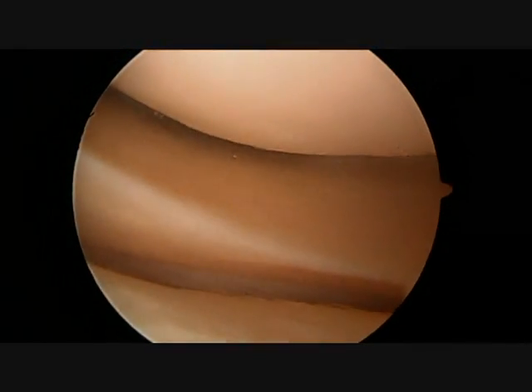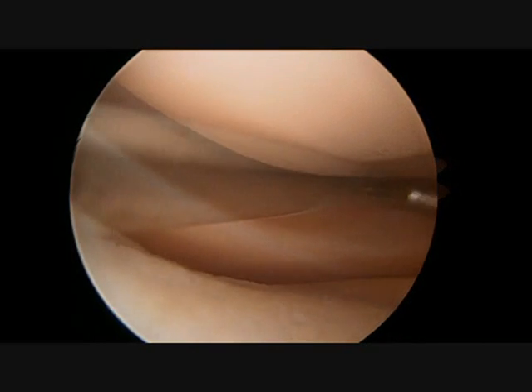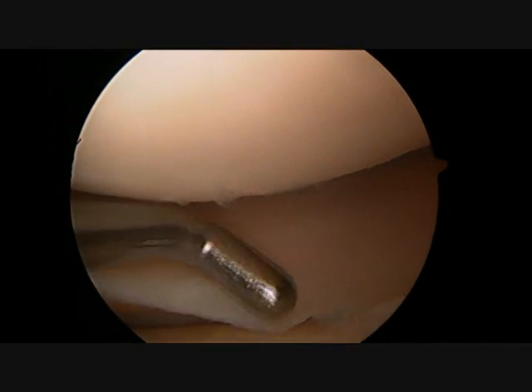The articular surface in this compartment is much healthier and smoother — much more like a freshly paved highway, not at all like the previous country road. The probe is used to examine the lateral meniscus for any abnormalities.